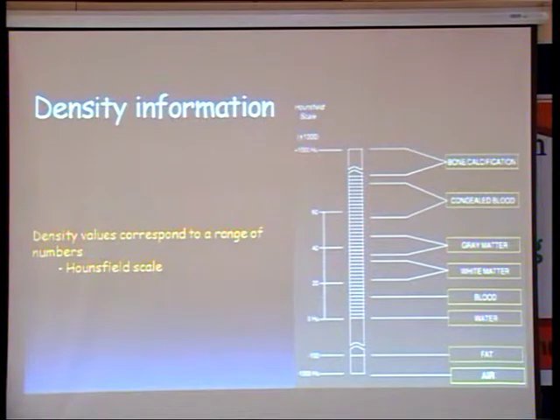Now, we all know, to penetrate a bone, we require more power, whereas for fat or softer tissue, we require less power. So this is the density graph. This is for bone and so on. You can see this is -1000 and this is +1000.